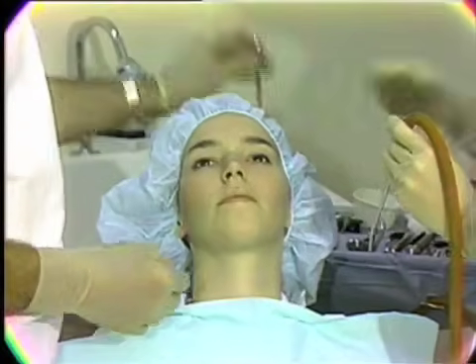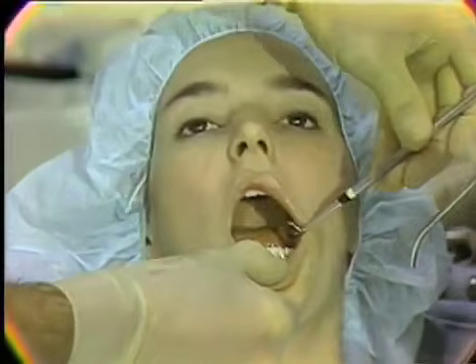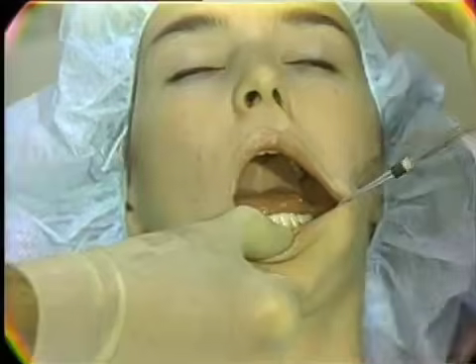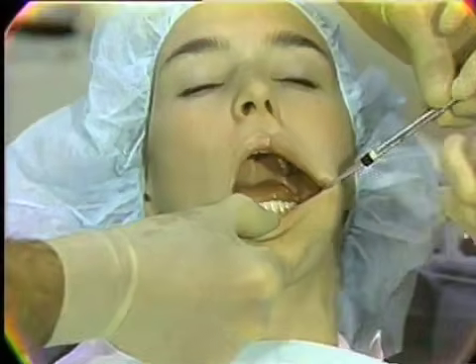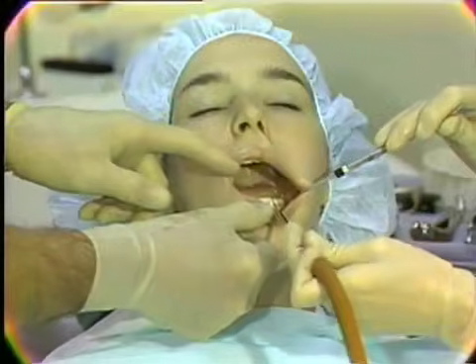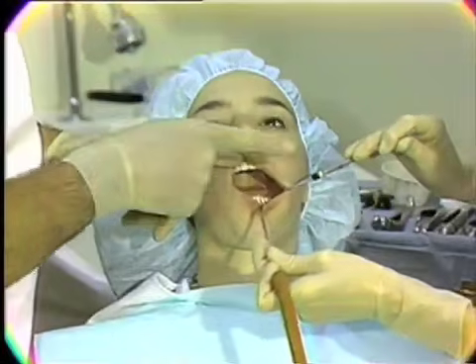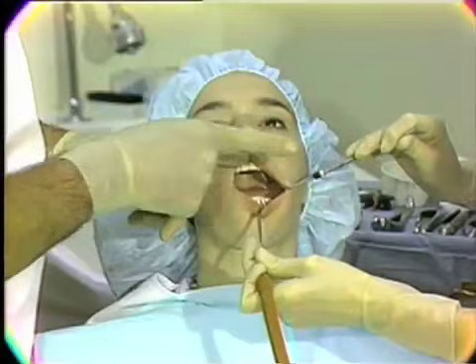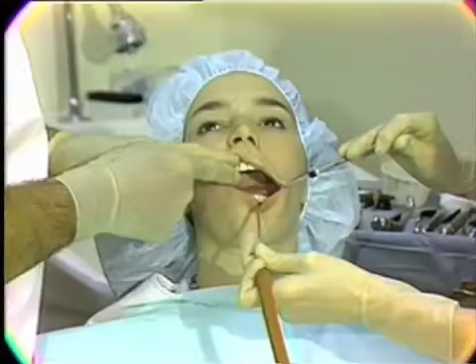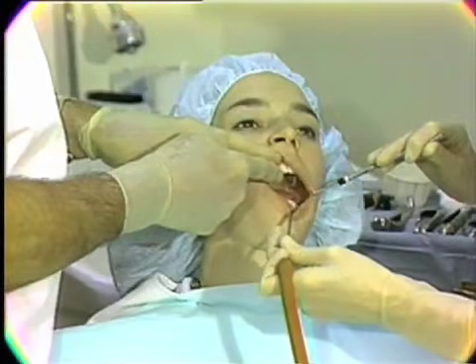And Ms. Itzel has the suction here, and this will be helpful in clearing the field as we approach the area for access. We've had the patient positioned, so when she opens, the mandibular occlusal plane is horizontal and parallel with the floor. The exposure of the field comes by way of retraction of the cheek. Patients will tend to want to cooperate with you, and when you retract in the direction, in this instance, toward the patient's left, her natural tendency is to comply and to turn her head toward the direction of the traction.